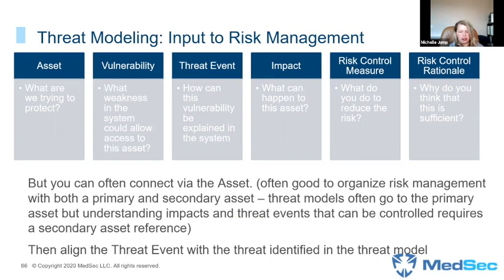But this also comes into the point. The reason I show you the columns is because it's important to understand how you connect the information coming out of the threat model with the information that's in the risk management file.